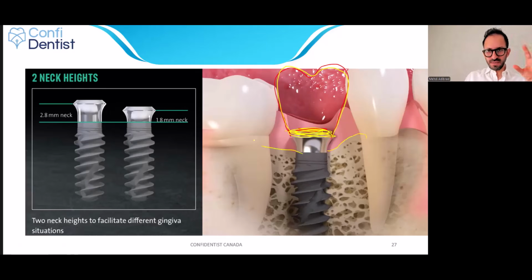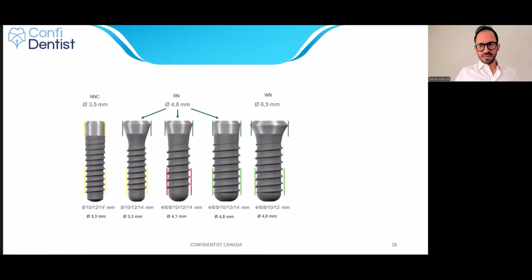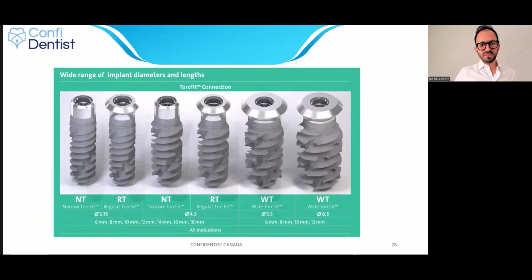Therefore, in cases that I have the tissue level implant, identifying the pre-implant bone loss is very, very tricky. And in the next lecture, I'm going to talk about it in more detail. Okay, and look at different designs for the tissue level implant.